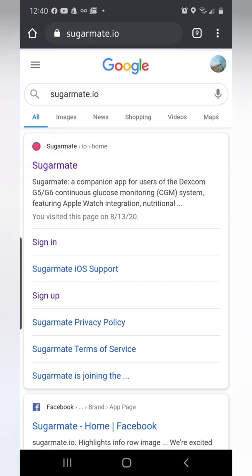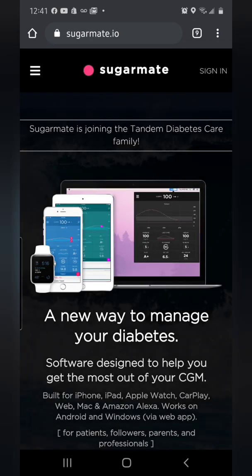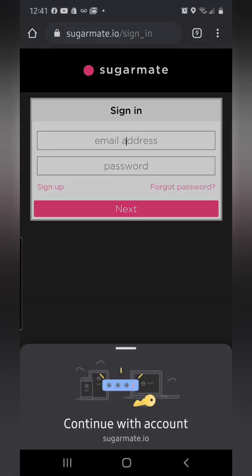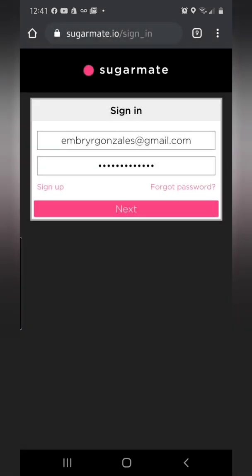It's going to pull up Sugar Mate — visit the site, this is what you're going to see. I'm clicking on the sign-in tab. In the bottom left-hand corner you'll notice sign up — if you don't have an account, this is where you would sign up. Use the email address that you also used to register your Dexcom G6, the email inside of your Dexcom app. Once you've done that, sign in to the Sugar Mate app.